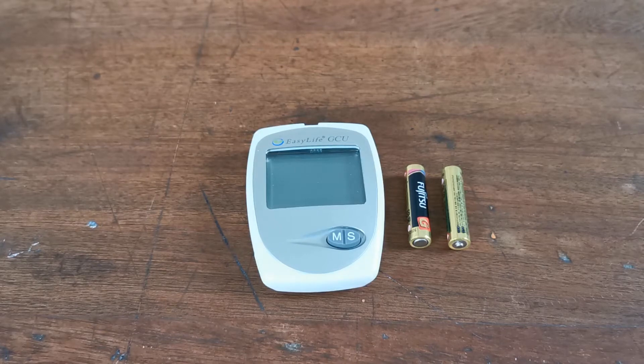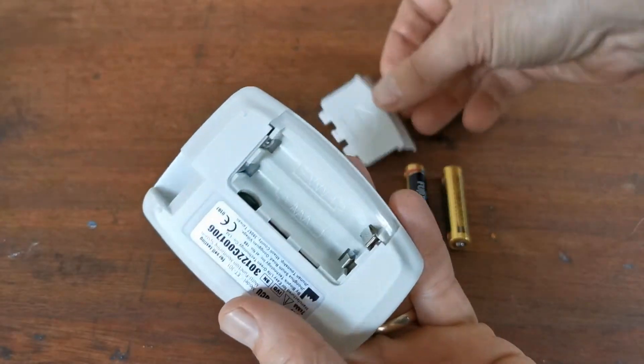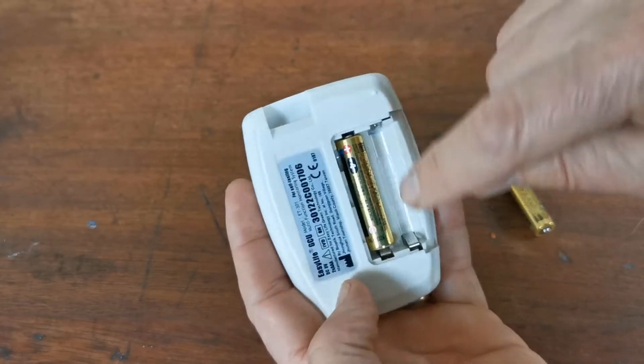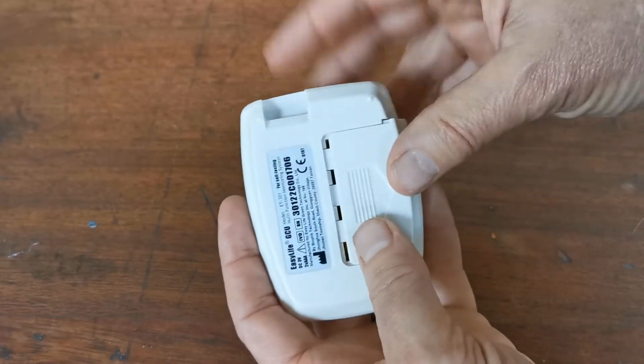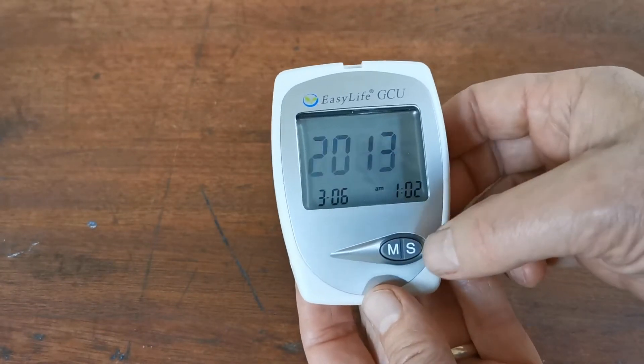We're now going to set this meter up with its time and date. Flip the meter over, slide the battery port open, and put your first battery in. It has clear instructions in terms of the alignment for the batteries. You'll hear it beep when the second one goes in, and if you insert it correctly you'll see the year flashing.